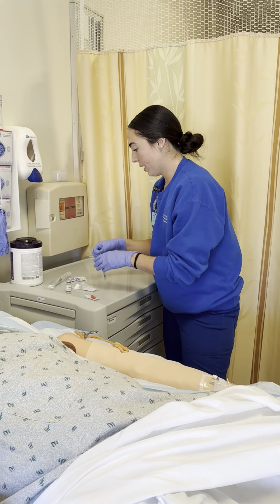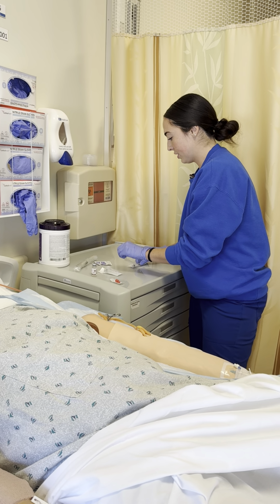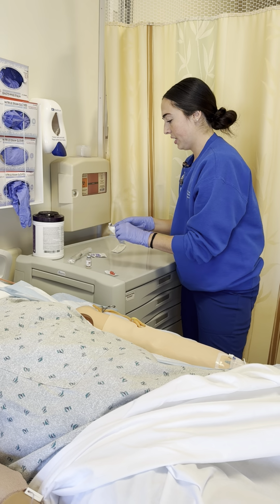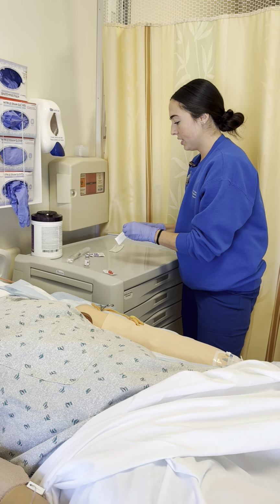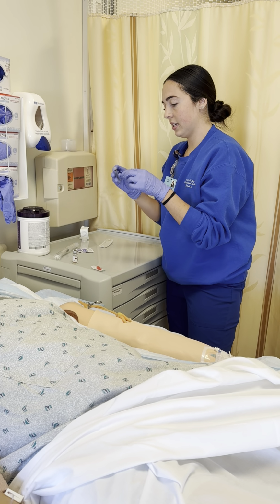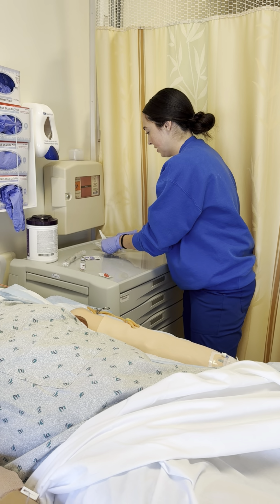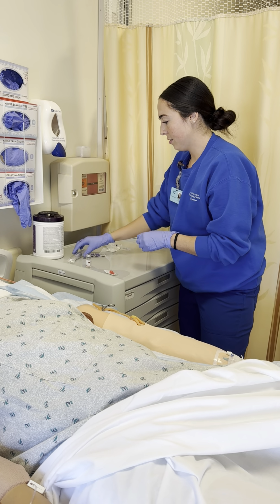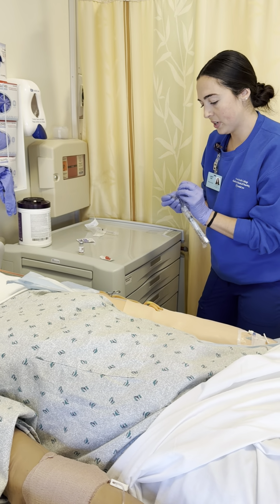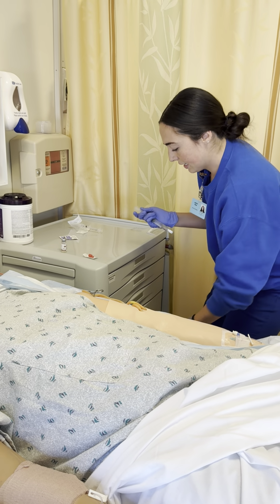So I'm going to go ahead and get everything ready to go. So the first thing I'm going to do is I'm going to prepare my needle. So I've got my syringe here, and I've got my needle. I'm going to lock that in. When I instruct you to do so, you're going to go ahead and put that in. Okay. And then open up my sterile flush, that way it's ready. I'm going to go over to that side.